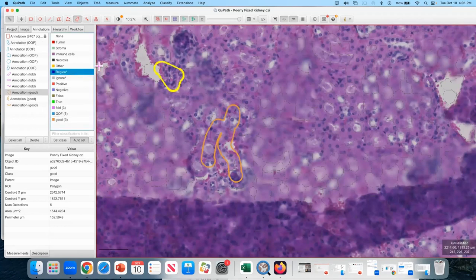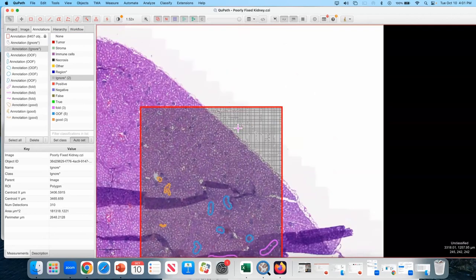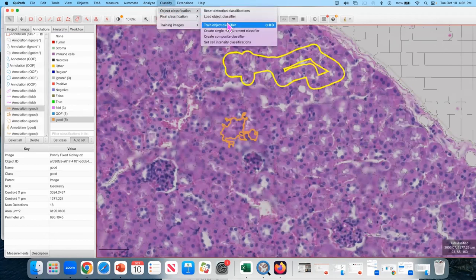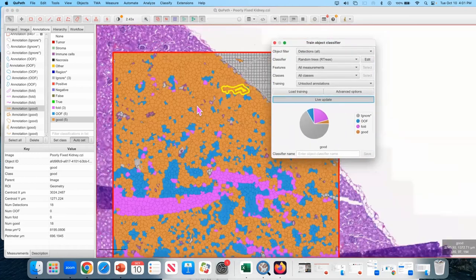And if you really want to get fancy, you can do, I'm going to ignore all of that because that's just white space. Good. Well, it's a lot of white space. Good. Okay. Classify, object classifier, train, live. Using areas this time instead of lines, because since these are in an object classifier, I'm using the areas.